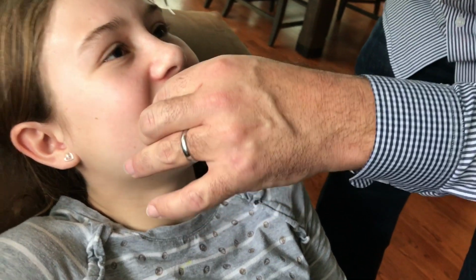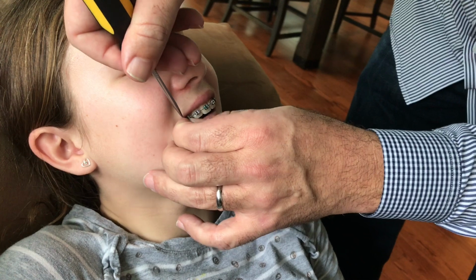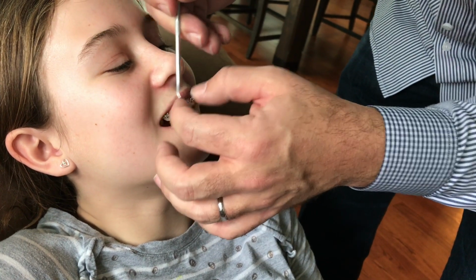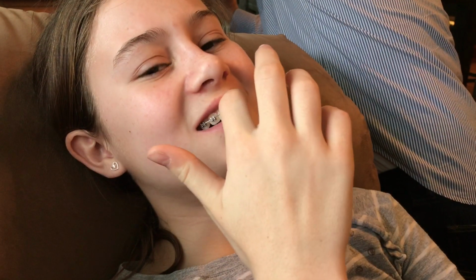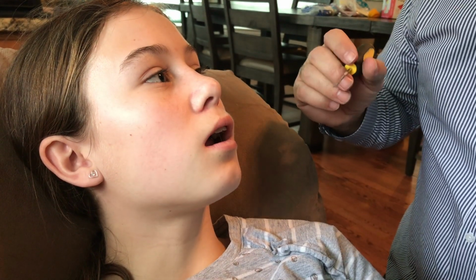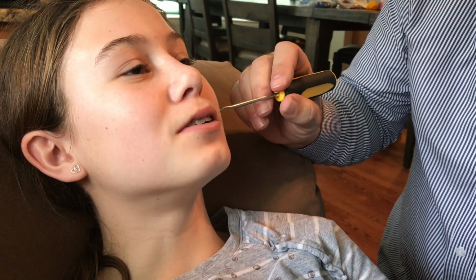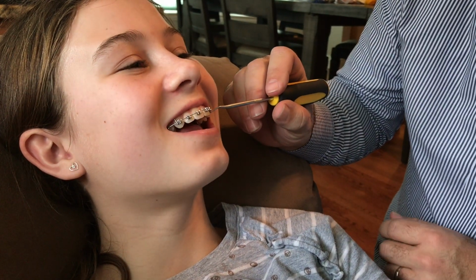What's it over top of? I know. It was over top of that big bar. Wait, show it. So we have to get the bands on the individual brackets off first before we get the wire out. Okay. Oh, that one. What are we gonna tell the orthodontist? That it was cutting you, and I didn't have a choice. Oh. Come on, look out. Open up.